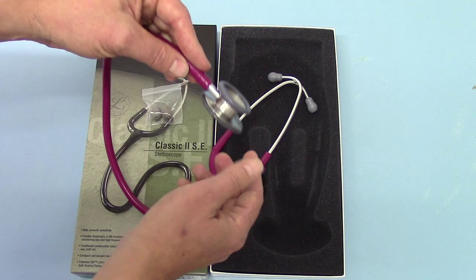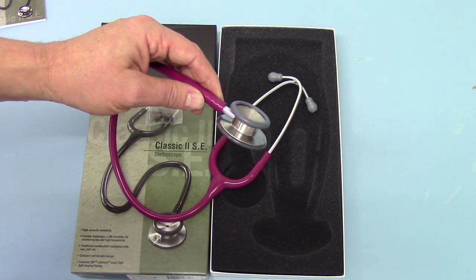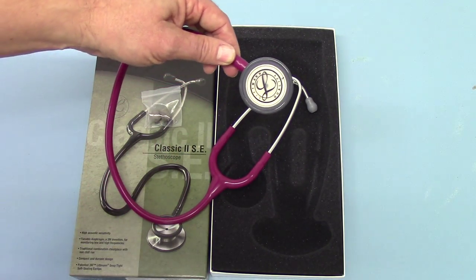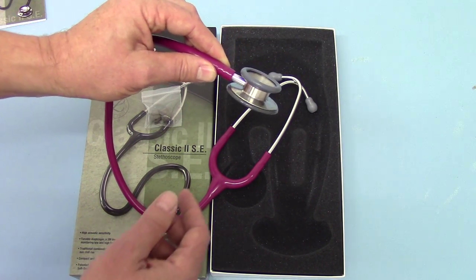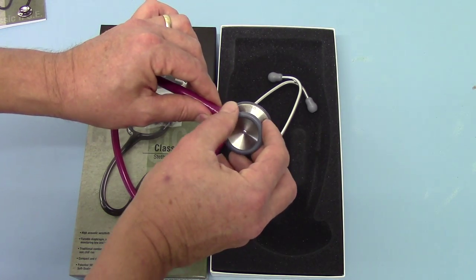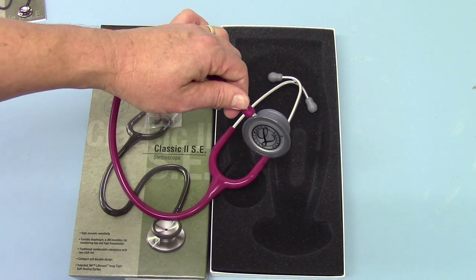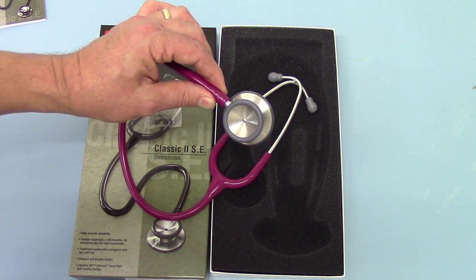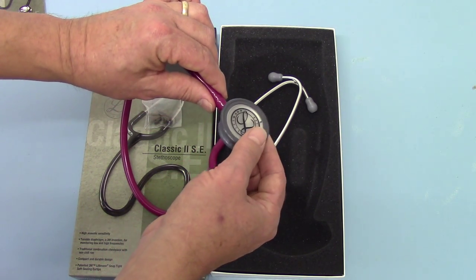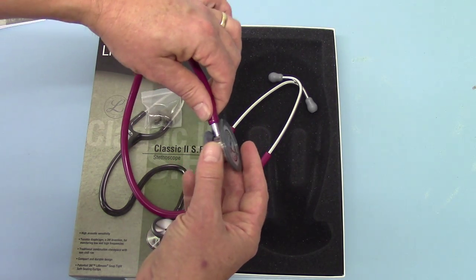Moving to the chest piece, you'll see this is the standard Classic 2 SE double-sided, standard adult-sized chest piece with the Littmann diaphragm fitted — the adult size. And then you've got a slightly oversized paediatric bell piece. There's no ability to fit that with a second diaphragm. It comes just with an anti-chill ring for use as a bell.